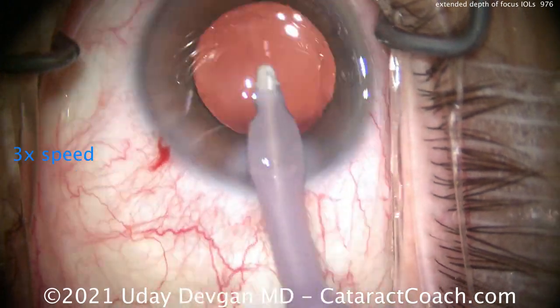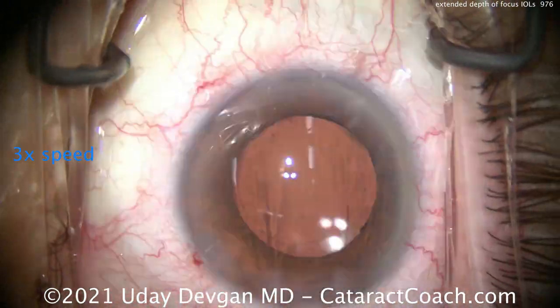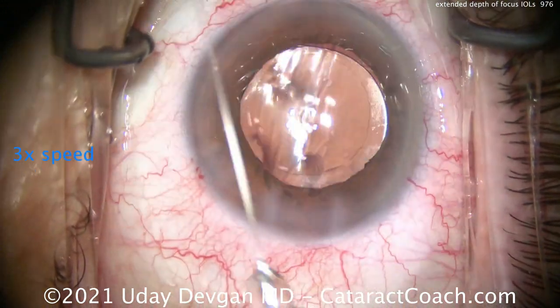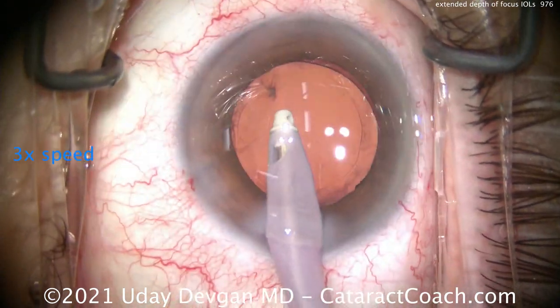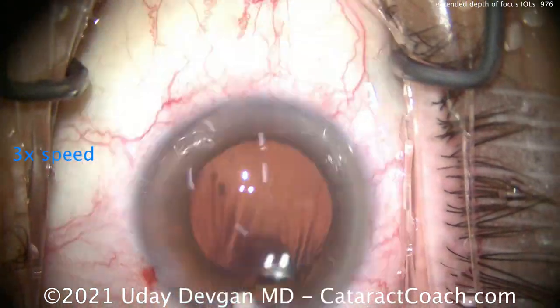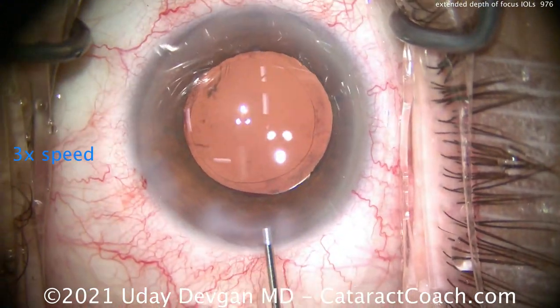This patient, fortunately, also has a very small angle alpha and angle kappa, so the patient's visual axis is very close to those Purkinje images. We'll seal up the incision and then adjust the lens position, having the patient look in the center of those lights.